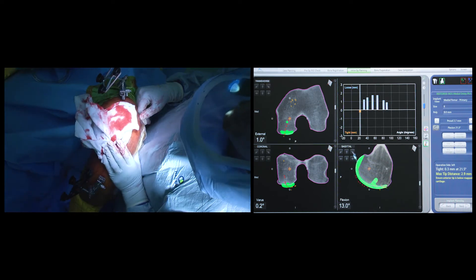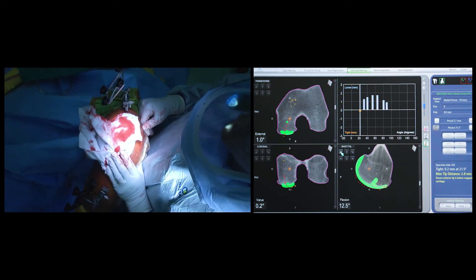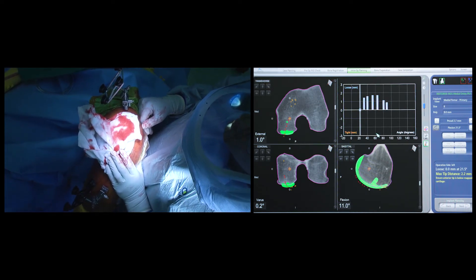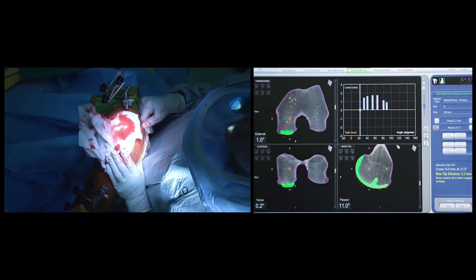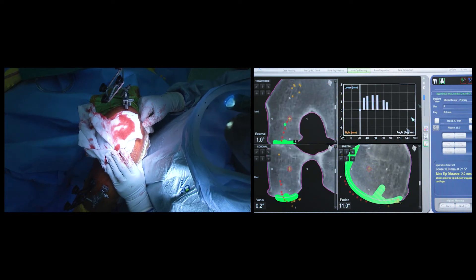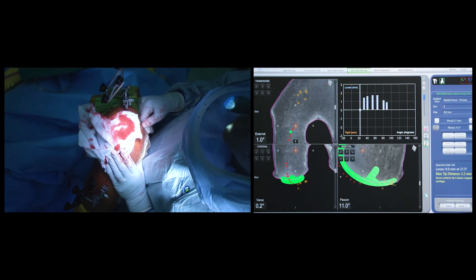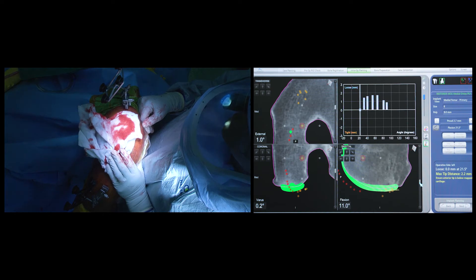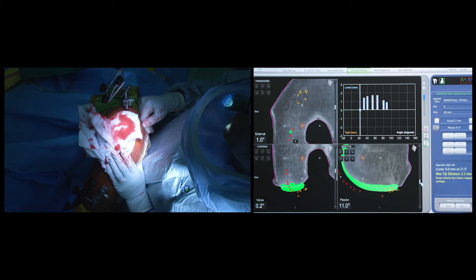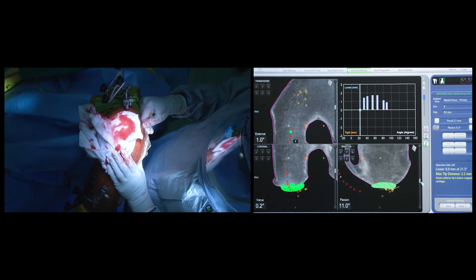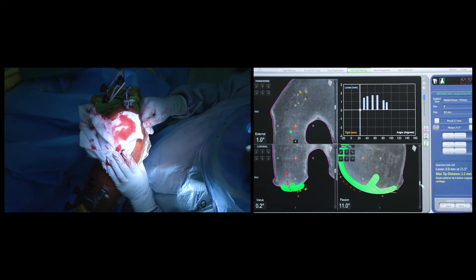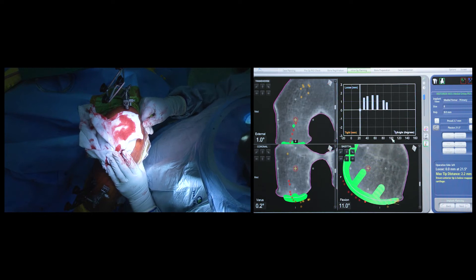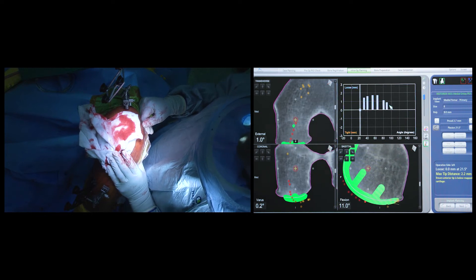Currently, there is no other form of technology that allows us to combine the information regarding the patient's bony anatomy and ligament tension to position the prosthesis in the most ideal orientation for improved function.